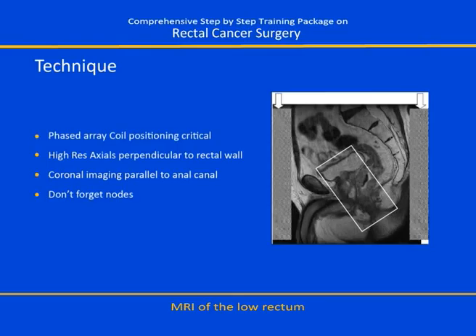Approximately what number of centimetres above the anal verge do we go from the first set of axial slices, which are at right angles to the anal sphincter, and then you get the horizontal segment, as we call it, which of course is part of our low rectal cancer group, and mostly mid-rectal cancer. Yes. So I imagine it must be somewhere about 5 centimetres.